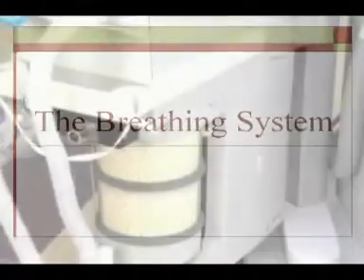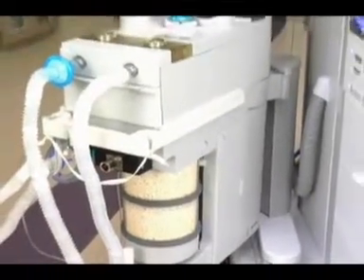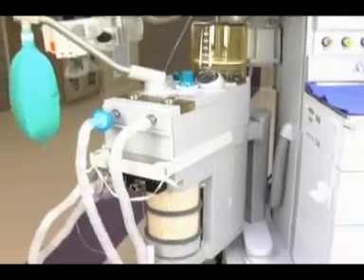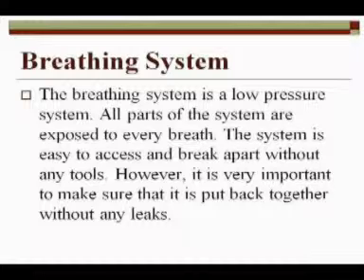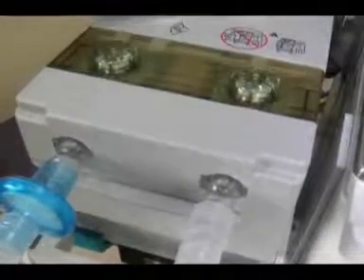Breathing system. During this module, we will discuss the various components of the breathing system. The breathing system is a low-pressure system. All parts of the breathing system are exposed to every breath. This system is easy to access and break apart when necessary without any tools. However, it is very important to make sure that it is put back together without any leaks.